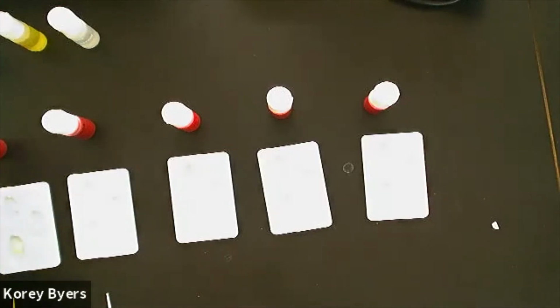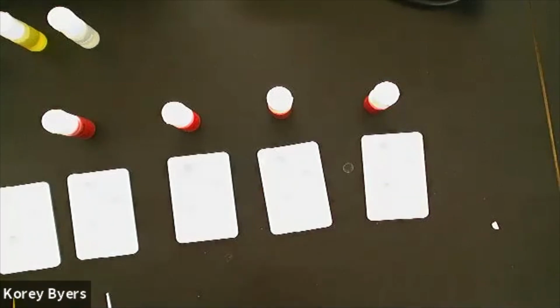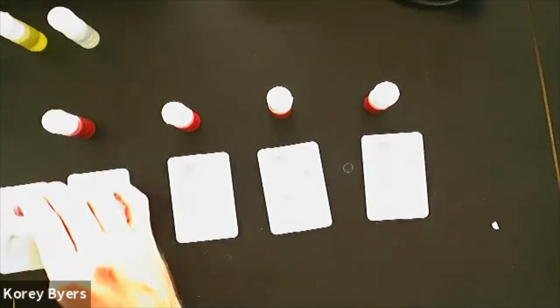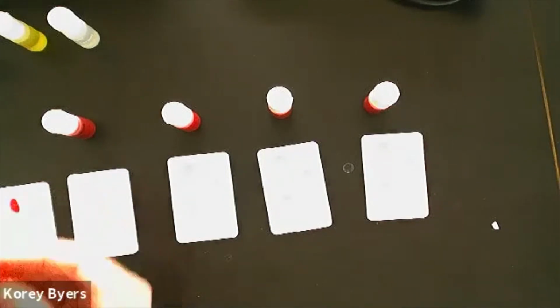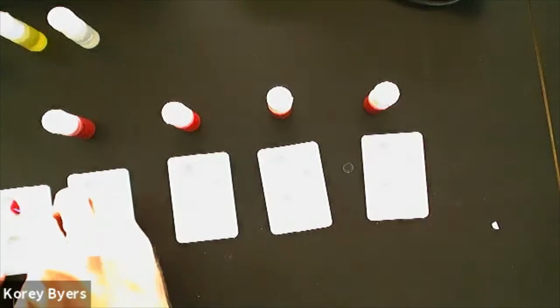Let's start with June. Let's figure out June's blood type. She's the mom, she's the first one. So you may need to shake it up a little bit. Open it up away from you. If it splashes on your clothes, it is stain. And then just take 1 drop and put it in the A. All it takes is 1 drop. And then take your blue toothpick and stir.